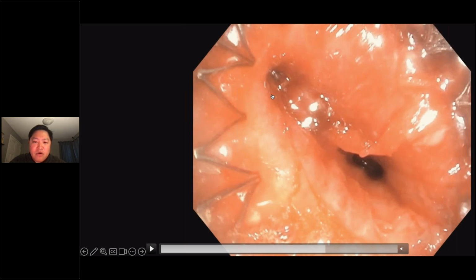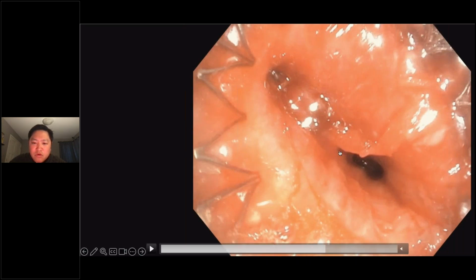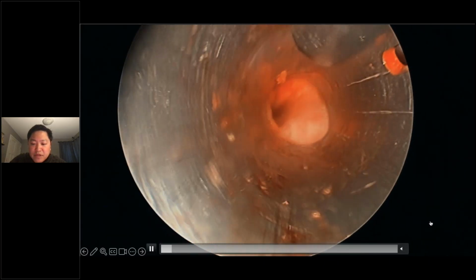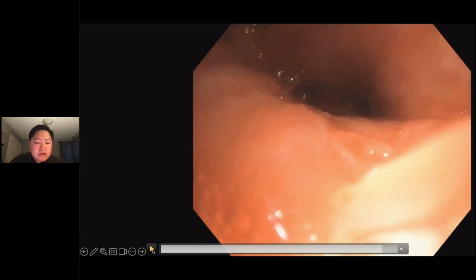That had no distal patency even when you put airway contrast through there, but the left lower lobe did. So this was one of the main reasons why we decided to keep this airway open, in addition to, obviously, the patient being in respiratory failure. Let me fast forward that. Let's see here.